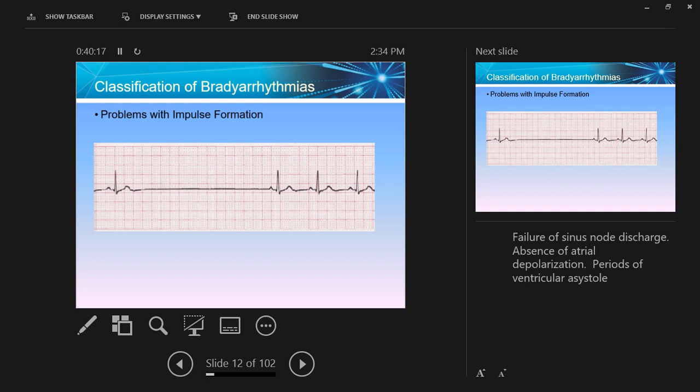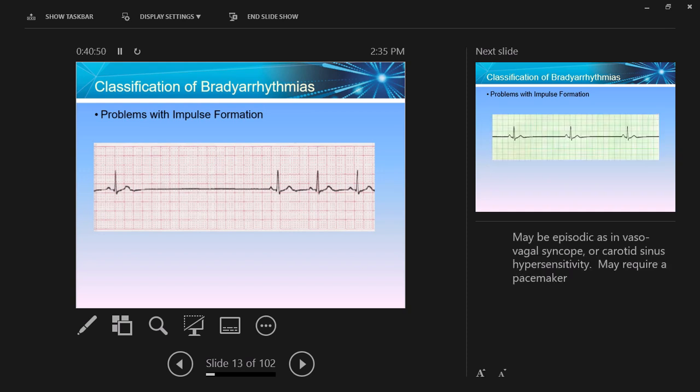When else might you see this particular type of rhythm after you've given a particular treatment to your patient? Boy, you are on a roll today, young lady. Yes, except we would see this being what? Probably twice as long. Why? Because adenosine wipes out the electricity in the SA node and the atria itself, okay? So that's exactly what we would see with this particular rhythm.